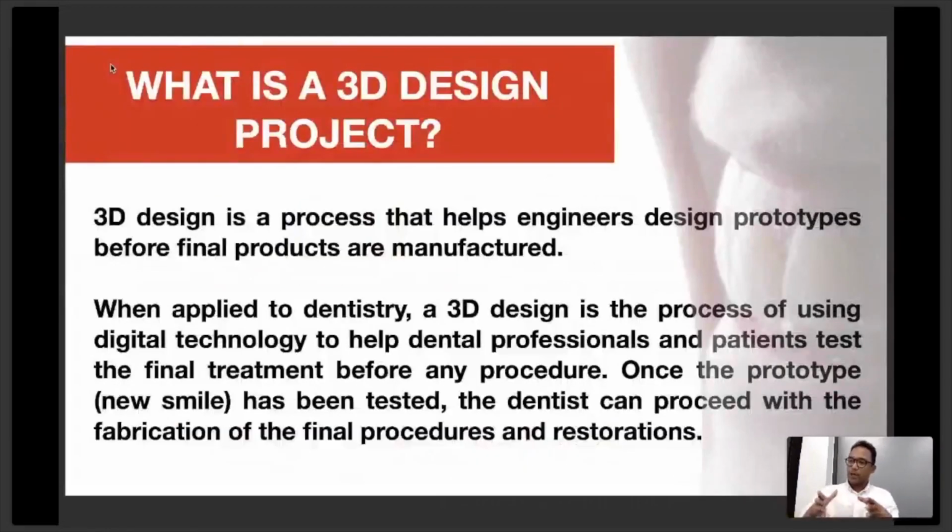So let's start with this question. What is a 3D design project? So let's read with me. A 3D design is a process that helps engineers design prototypes before final products are manufactured.